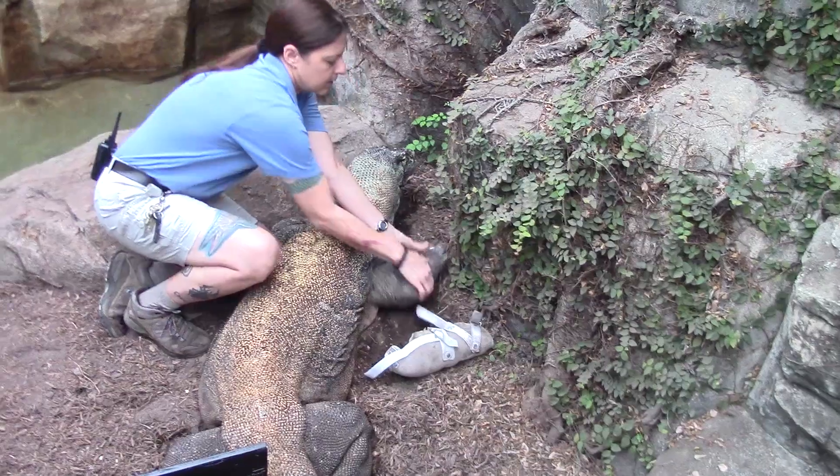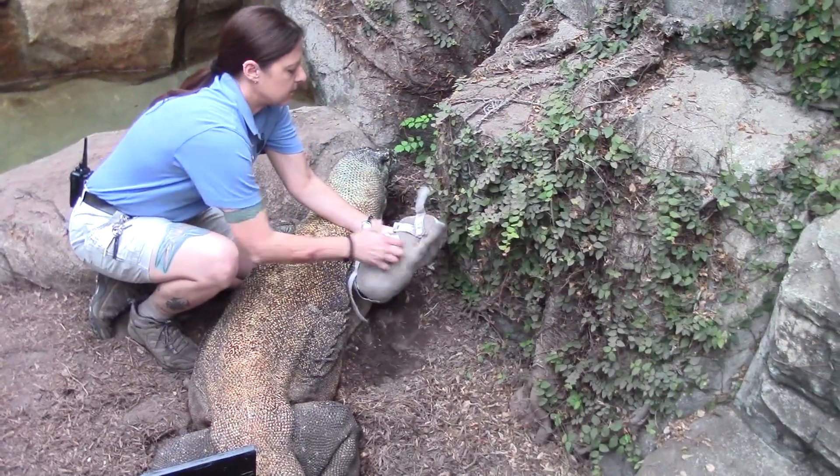We started out from the human perspective, just treating him as if we would any other patient. We cast him similarly, used the same methods, and when we put it on we thought it looked great and worked great — we were pretty pleased with ourselves. And then all of a sudden it just blew off within a matter of seconds. We realized this was going to be a bit different, and that's why we looked at new materials and different methods.